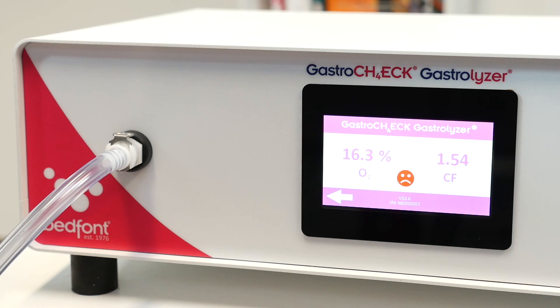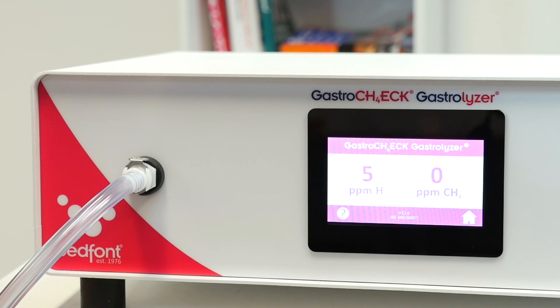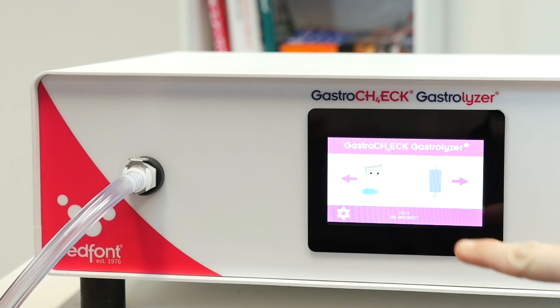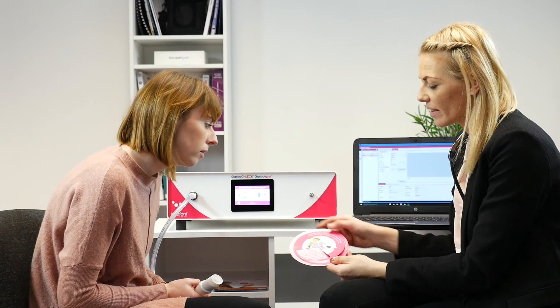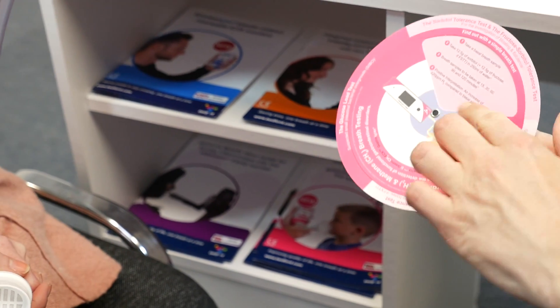If a red unhappy face is displayed, it is recommended to retake another test. Press the back arrow to return to the results. If you are recording the results manually, note them now. Press the home button to return to the home screen where you can repeat a breath test if necessary. Readings and results can be interpreted using the interpretation wheel included with the Gastro Check.